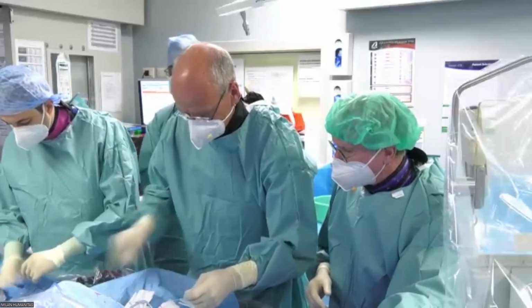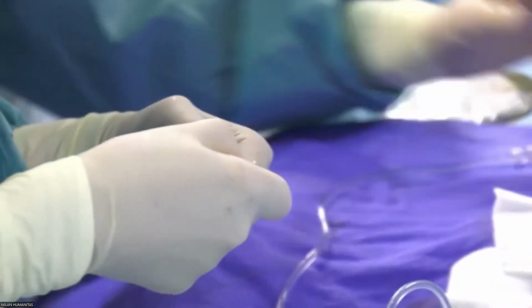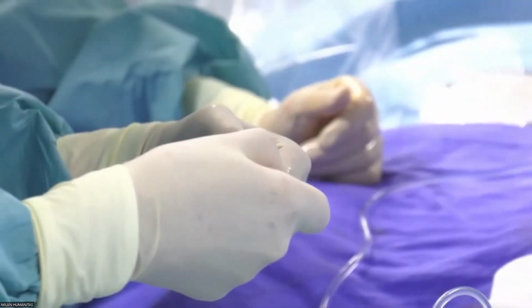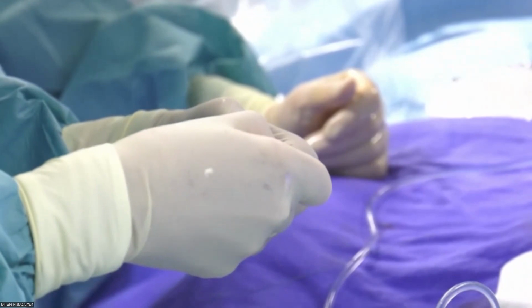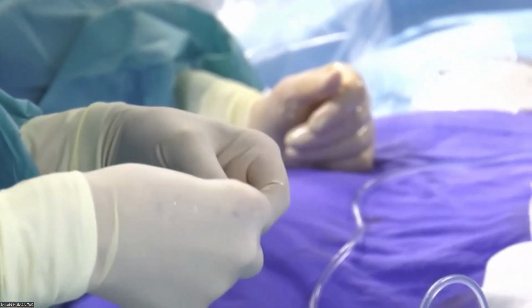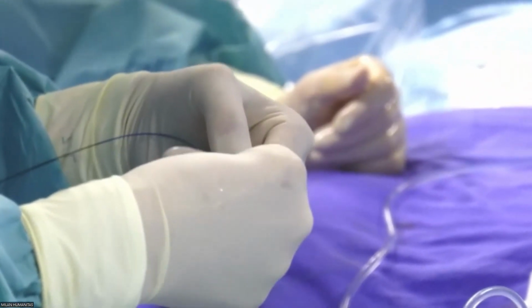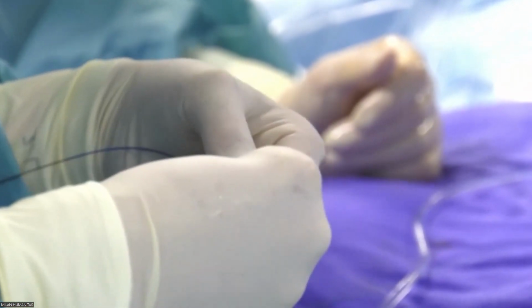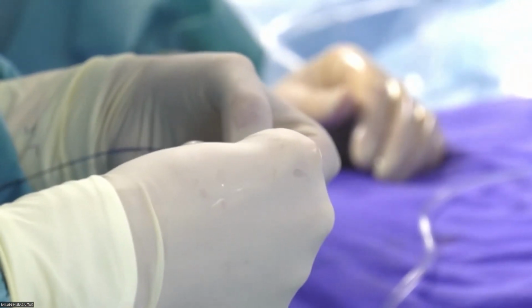Still, of course, approximately, I will go for the stent. But, you know, we used to do the same. But if the result is good, you're still delivering the drug. I don't know. I'm not against stenting, but I think the marginal gain is marginal.